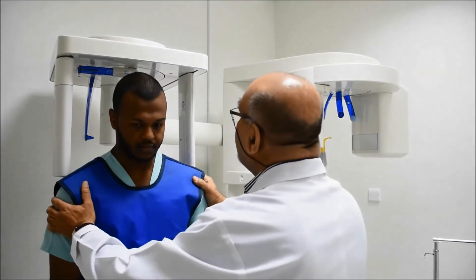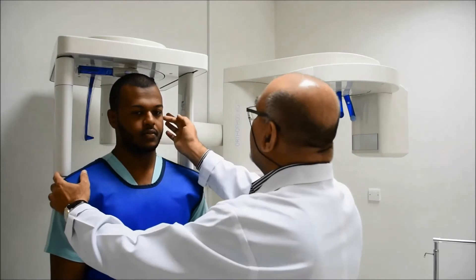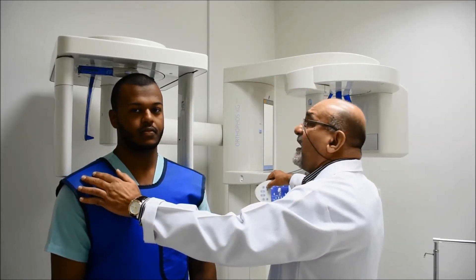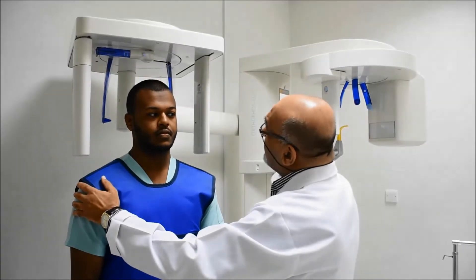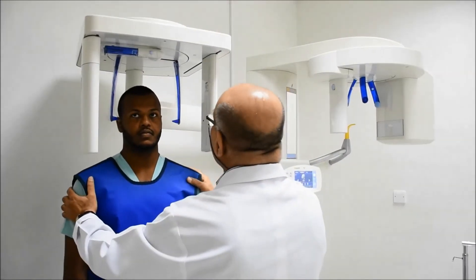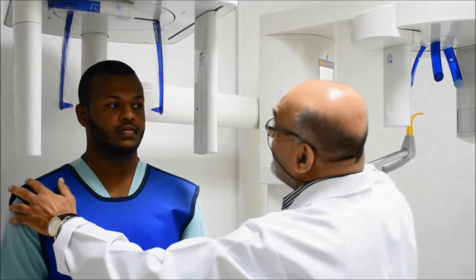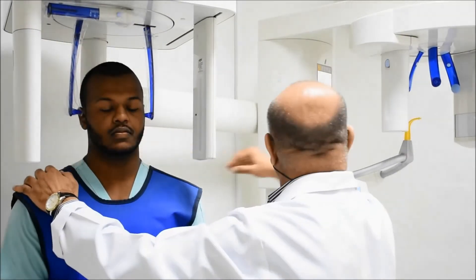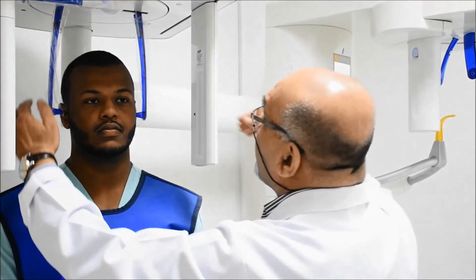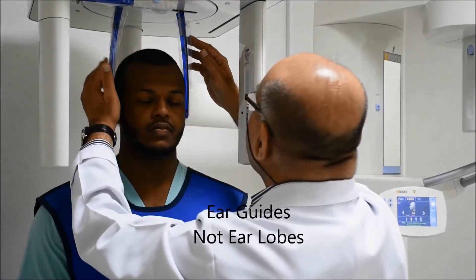Guide the patient backwards. For this patient we need to raise the machine so that the ear olives fit into the external auditory meatus. Move it up slowly then it moves faster. I'll bring it down a few millimeters — okay, now the two ear olives should fit. Just snap them in; you don't need to push hard.